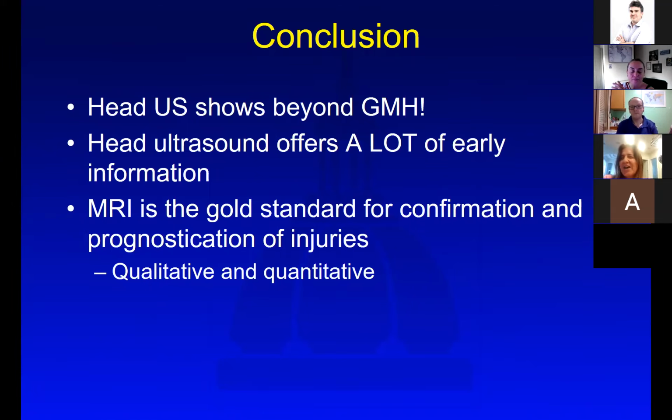And even for young children, like 2, 3, 4, 5, it's a hit or miss. Sometimes we get really good image quality. The way I manage is I disclose the limitation, and I report it as such in my reporting. I mention the limitation.